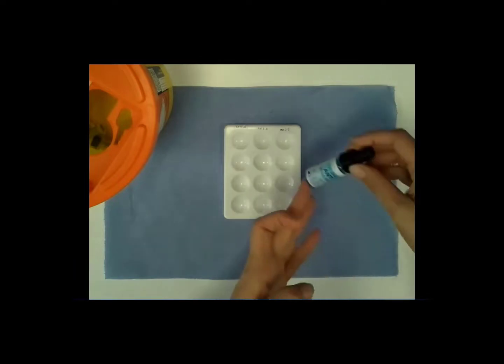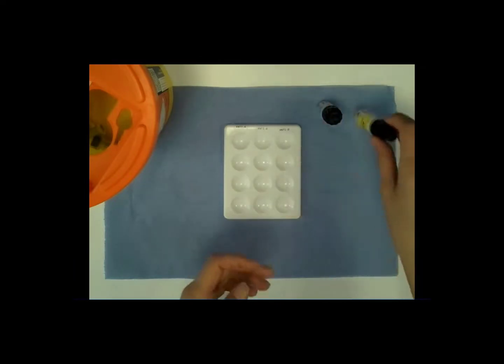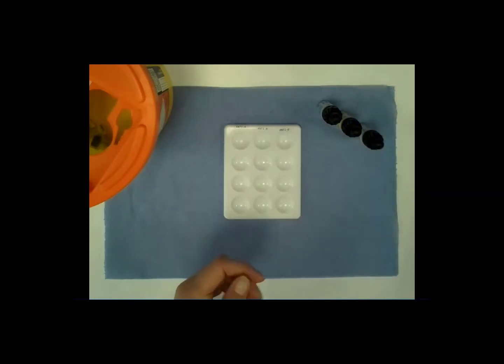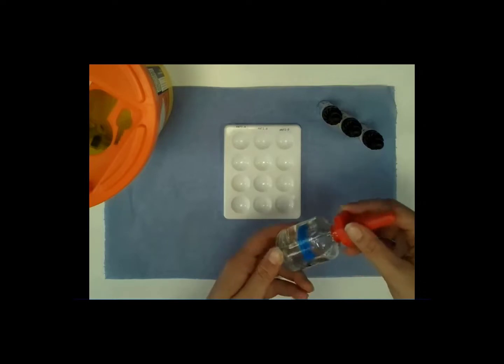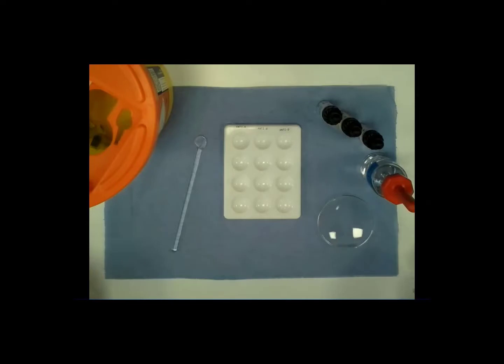You're also going to need one of each of the antibodies. They're labelled and are different colours so it's easy to identify them. You'll need anti-A, B and D. You'll also need a bottle of saline, a watch glass, and a glass stirring rod.